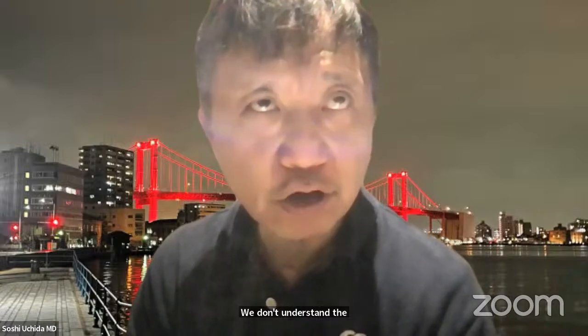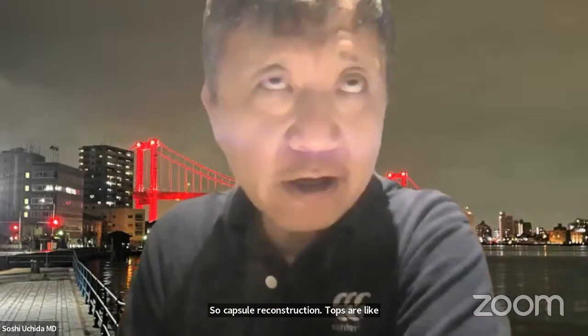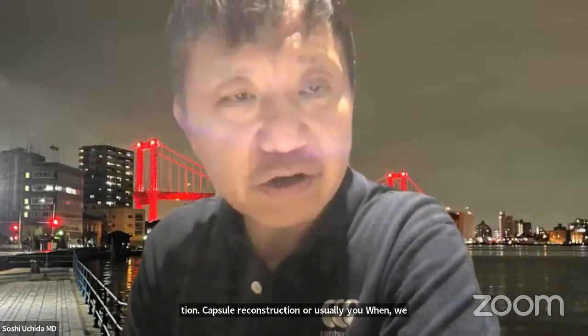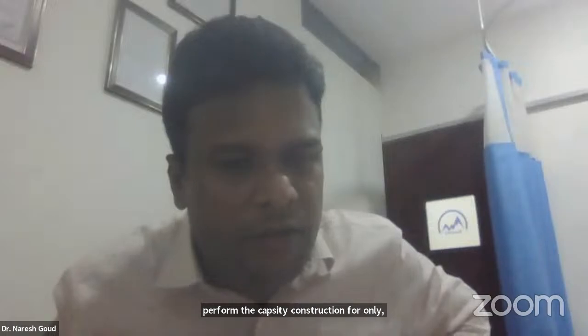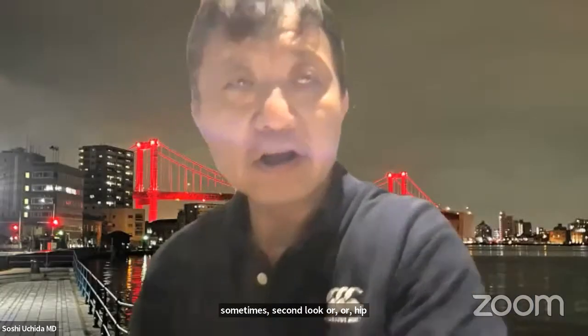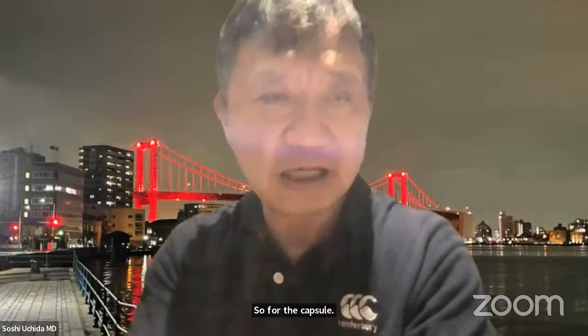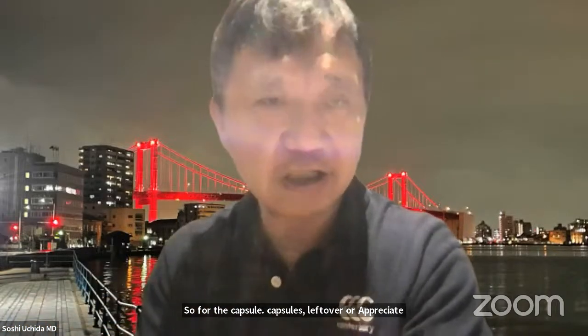We don't understand your question. For capsular reconstruction, we usually perform it only for revision cases, because sometimes in second-look or third-look hip arthroscopic surgery there is capsulotomy left over, or the capsule is not torn but just open.